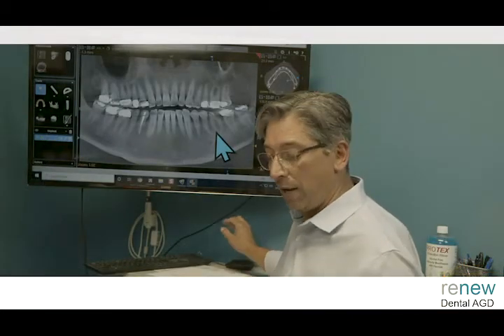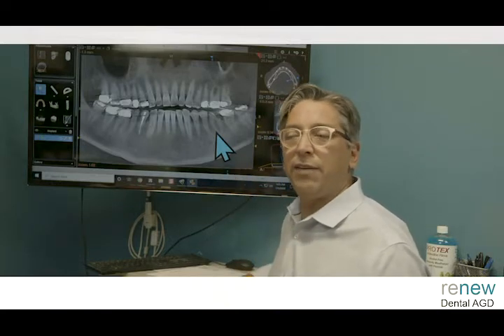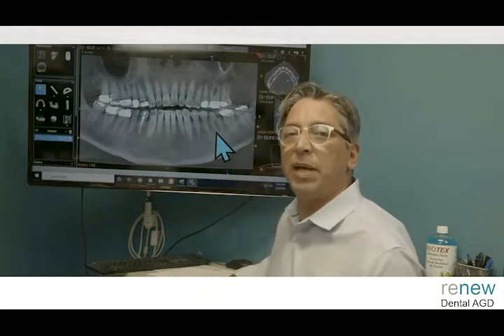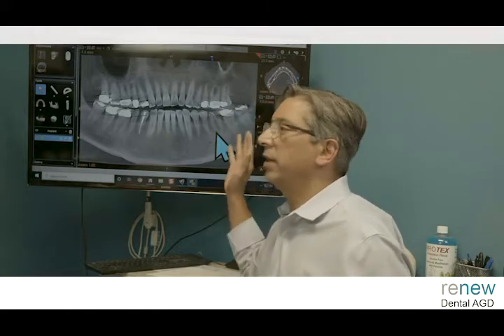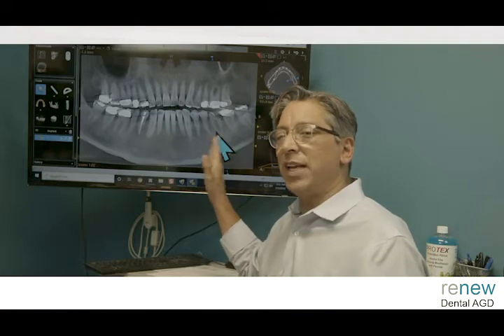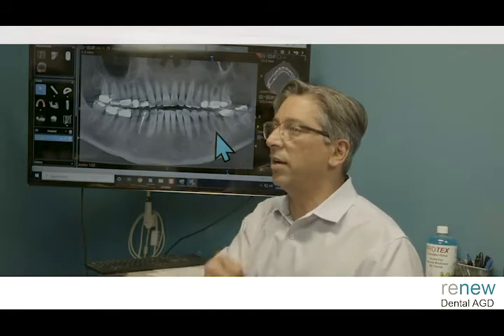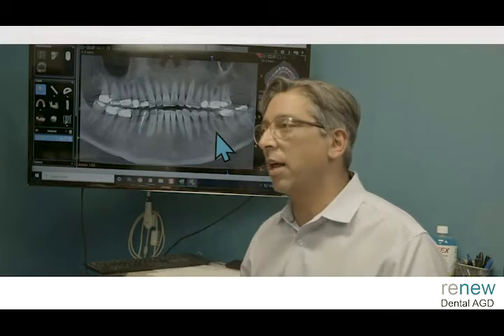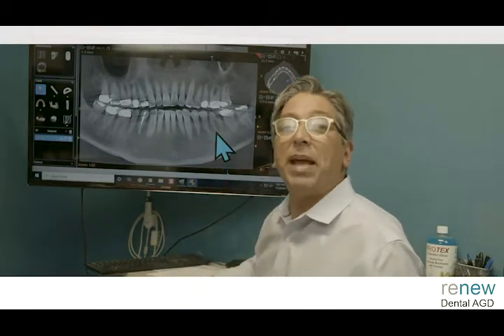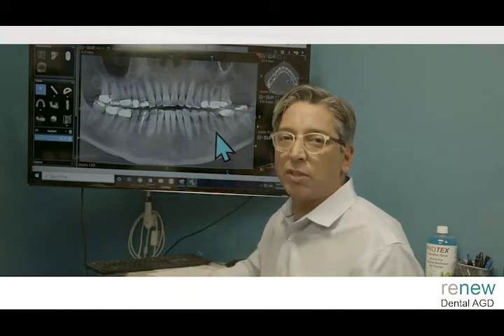So anyway, I hope that was helpful. If you have a CT, if you're a dentist or even a patient that is interested in doing these simple single tooth replacements, remember that not everybody's the same, and you can't always just put the implant in and put the crown on. You're going to be a loser in a lot of those cases. So just be patient with the cases. Be patient. You'll have the better lifetime results that we're trying to look for.